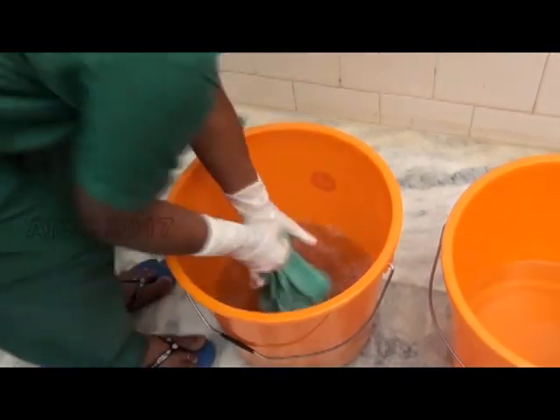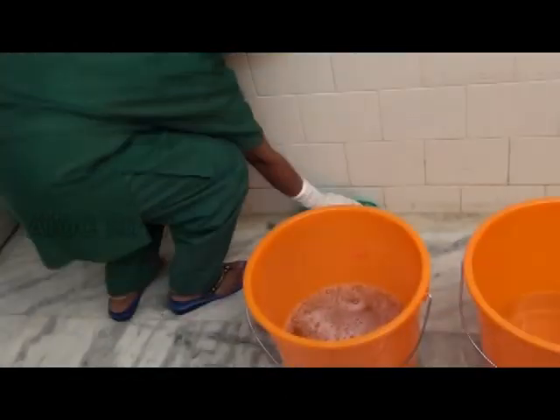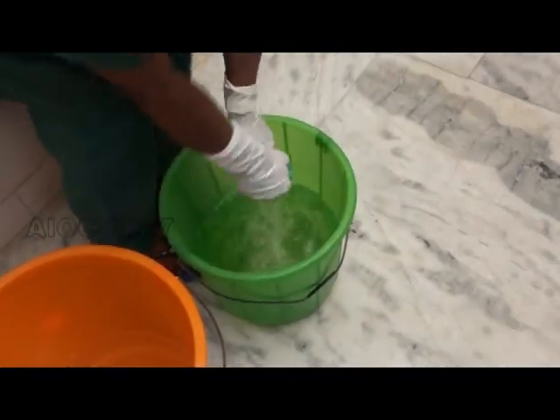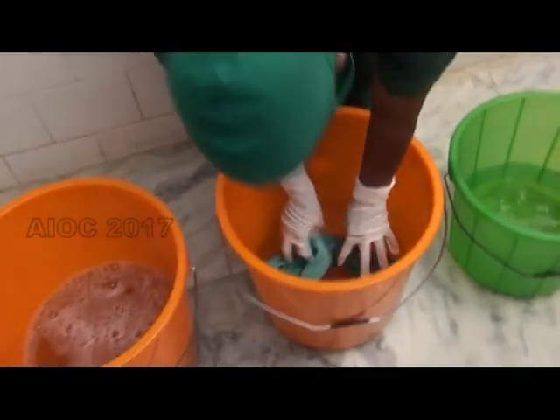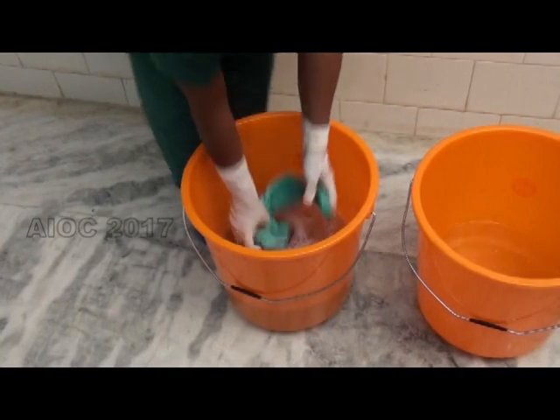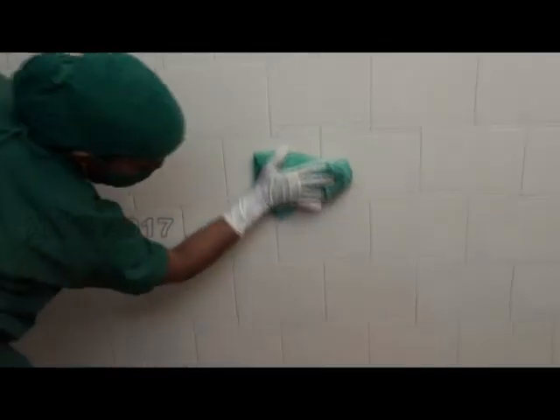This is the three-bucket technique which has to be followed for disinfecting surfaces like the wall and the floor. The first bucket contains the disinfectant and the other two buckets contain clean water. After wiping the surface, the cloth is rinsed in the water and then in the disinfectant before wiping the surface again.